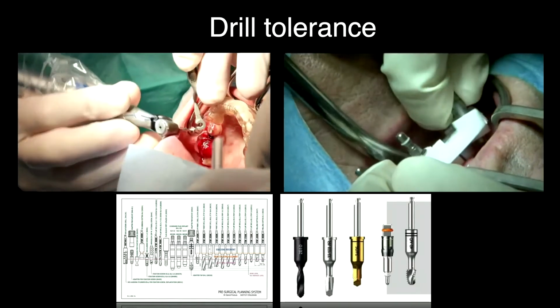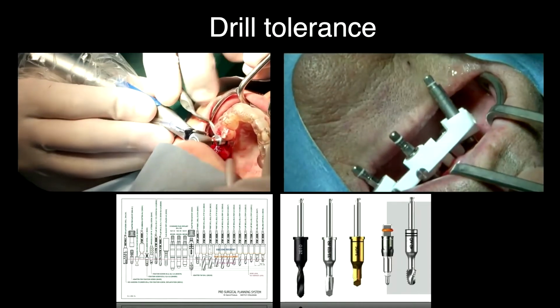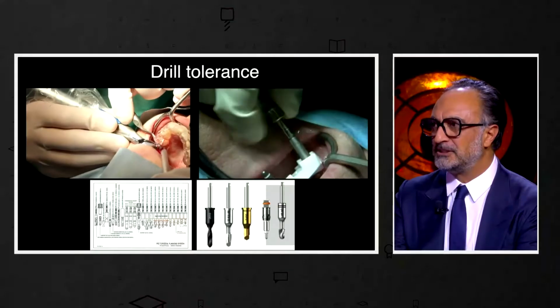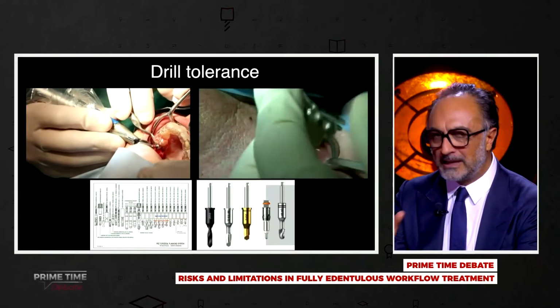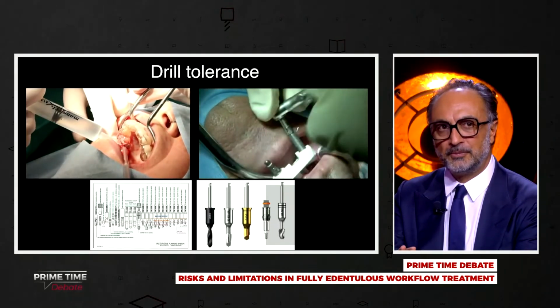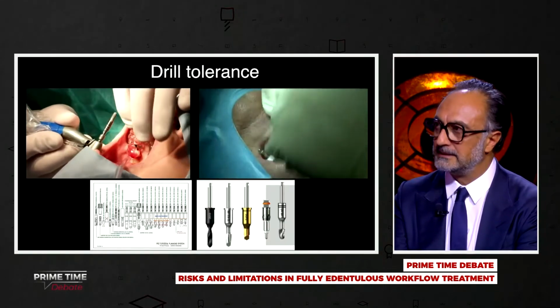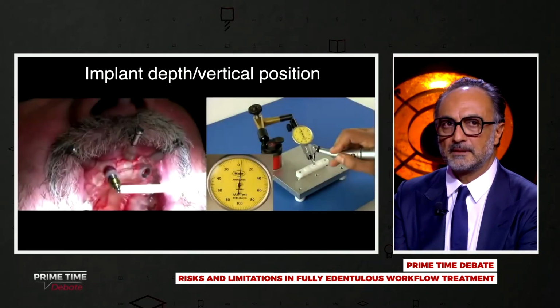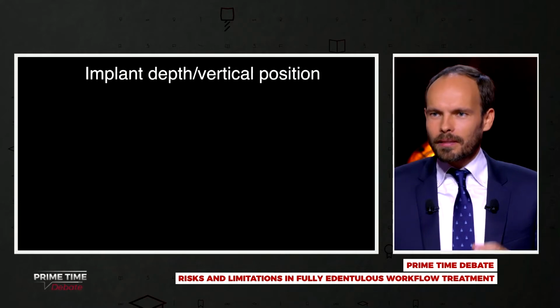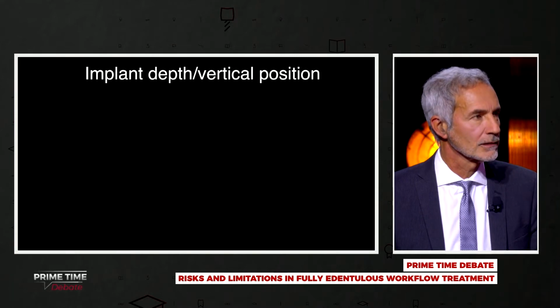These drills make sure that you have less inaccuracy, and it really helps if you do the surgery. Because, as we discussed before, I think every step is important. But the major deviations happen during the surgery. If you have a fantastic acquisition of your data, you did your best, you have excellent computer people, but still when you are doing the surgery, you can really mess up your whole case. It goes all the way to the height of the sleeve. Exactly. You have several positions, 2 millimeter, 4 and 6. It just brings up more potential for deviation. The further from the bone, the bigger the deviation.